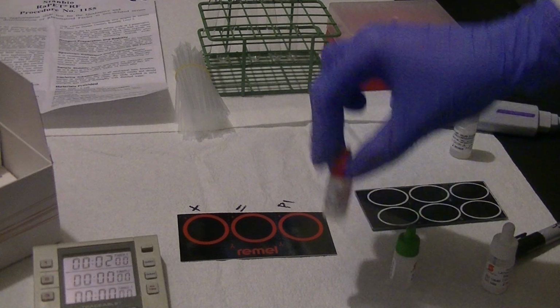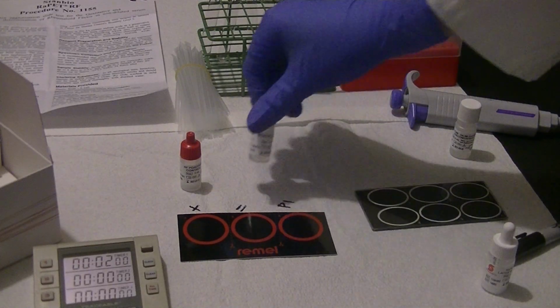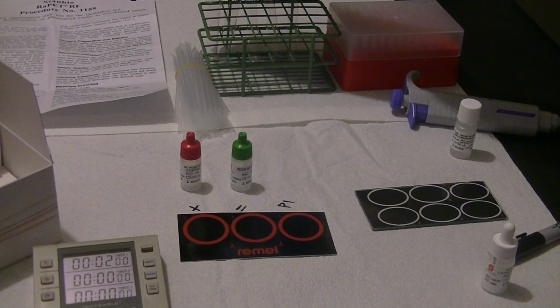Also included in the kit are the positive control vial, the negative control vial, and I have some patient serum sample here in a tube.